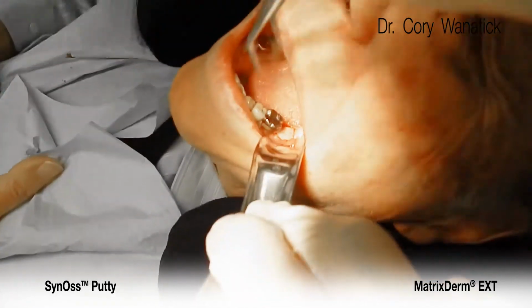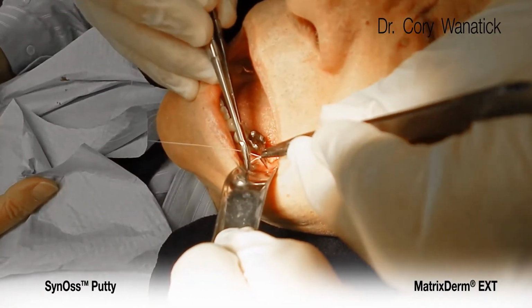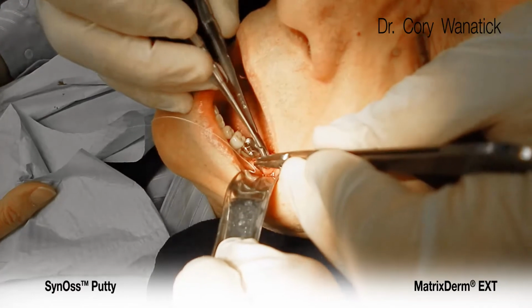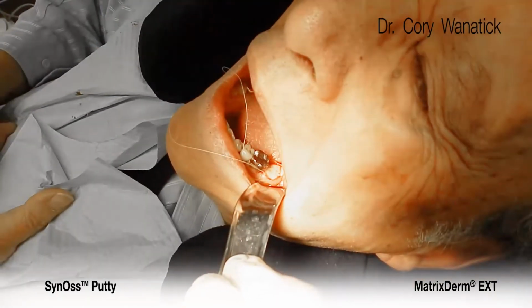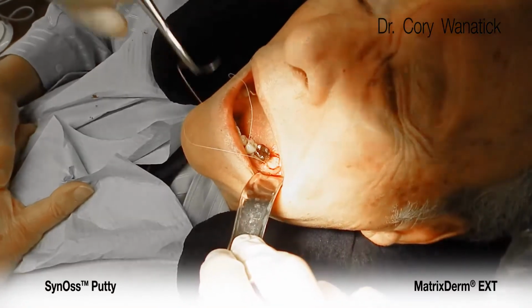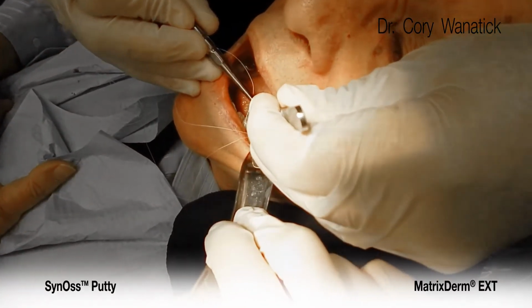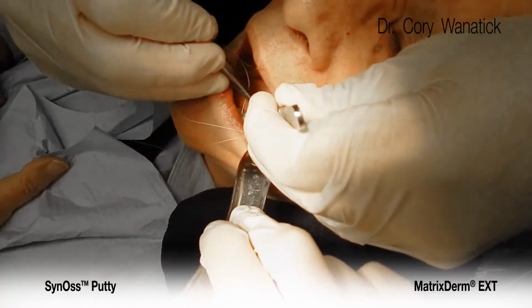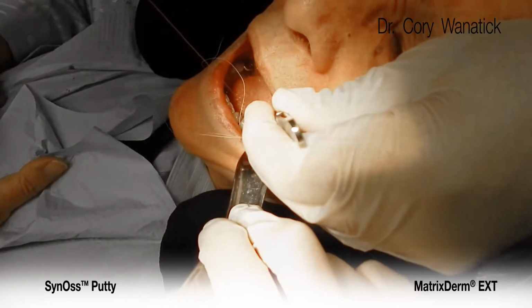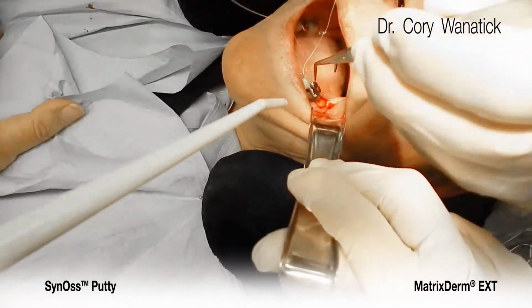We'll now take our 4.0 polyglycolic suture and in a figure 8 fashion close up the socket, or at least get coverage over the membrane. The membrane is suturable as well. In some instances, if you want to or you need to have stability, you can suture through without any ill effects.